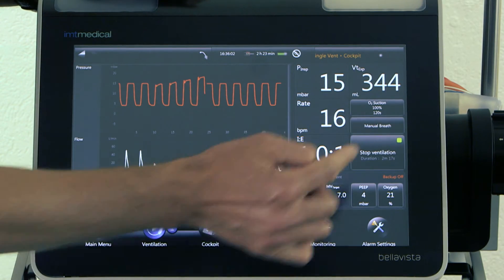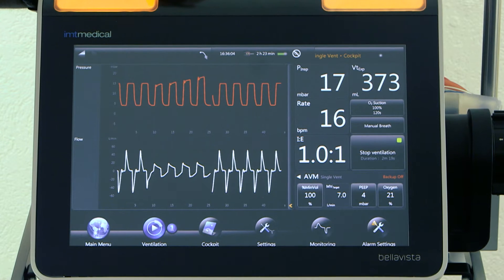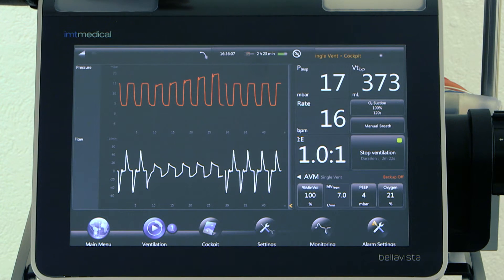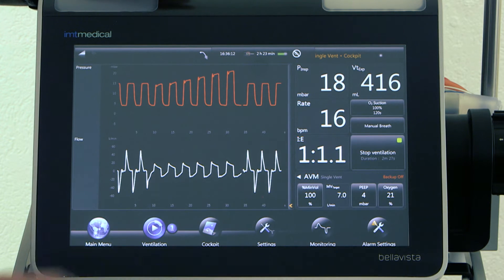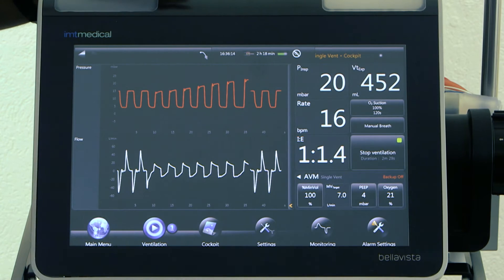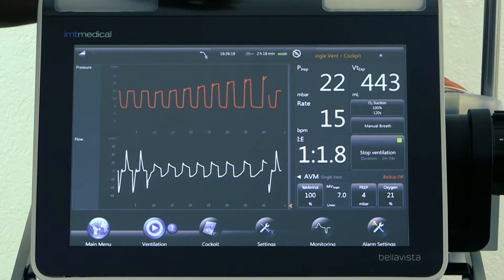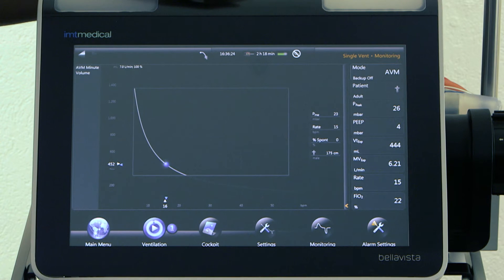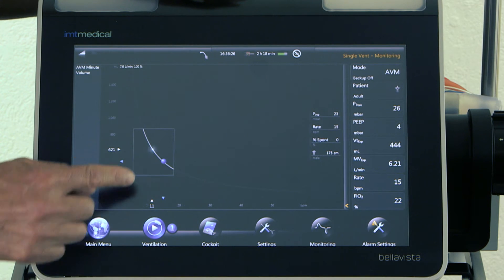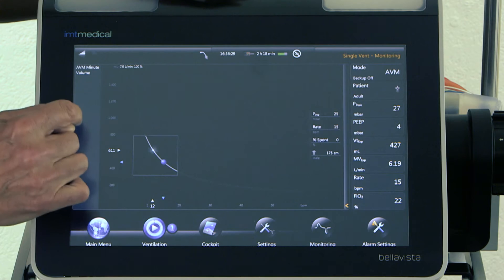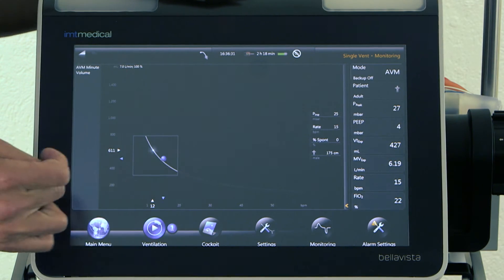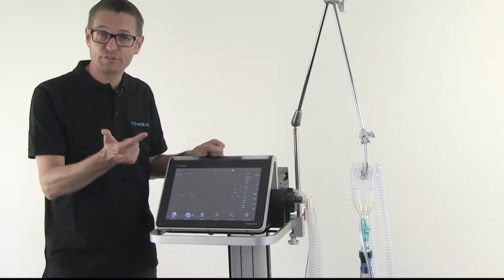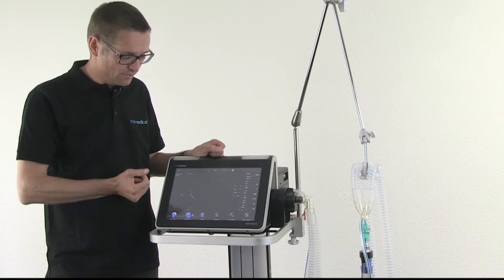Let's have a look at what the I:E ratio is going to do shortly. The I:E ratio starts to increase, giving more time for exhalation. Tidal volume has to increase of course to deliver the same minute volume. Looking at the AVM graphic, it's working its way up on tidal volume and down on rate — so the rate will be reduced, more time for expiration, and an increased tidal volume.